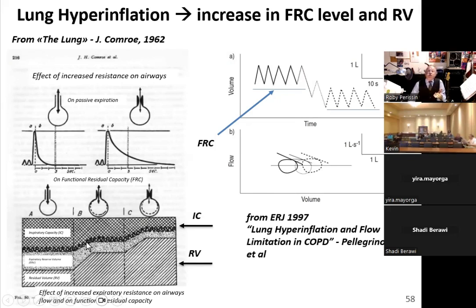It shows that when a patient has a severe obstruction, they inhale and exhale, and the system doesn't give them enough time to exhale before catching the next breath. What happens in COPD patients, as you are aware, is called lung hyperinflation. The patient, by himself, defends against the flow limitation that they experience and starts increasing the lung volume, so he breathes at a higher lung volume.